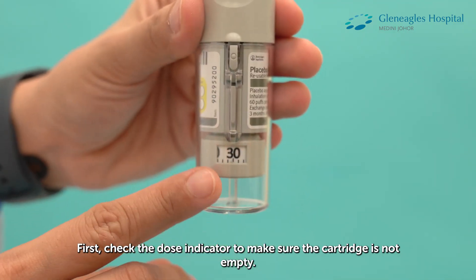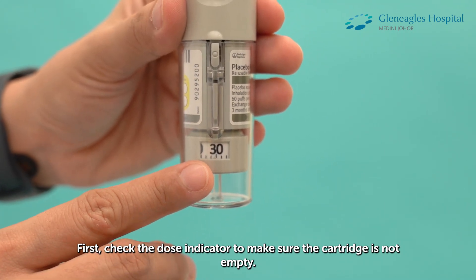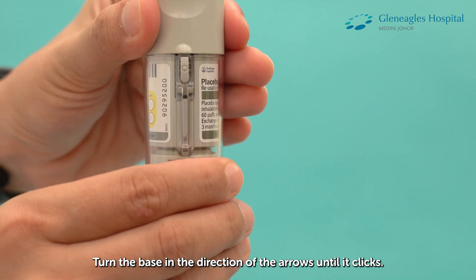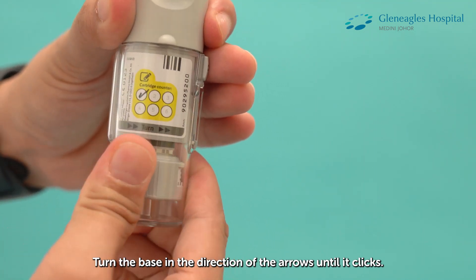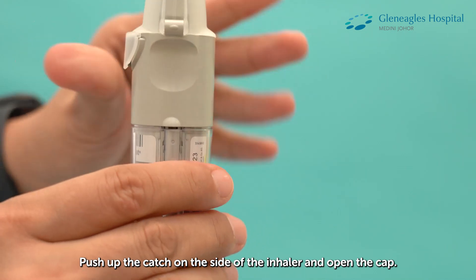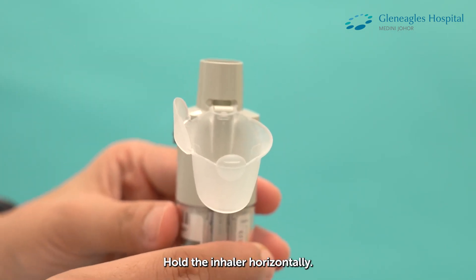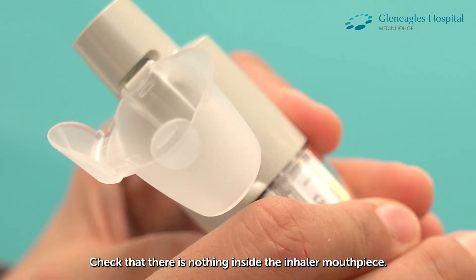First, check the dose indicator to make sure the cartridge is not empty. Hold the inhaler upright with the cap closed. Turn the base in the direction of the arrows until it clicks. Push up the catch on the side of the inhaler and open the cap. Hold the inhaler horizontally. Check that there is nothing inside the inhaler mouthpiece.